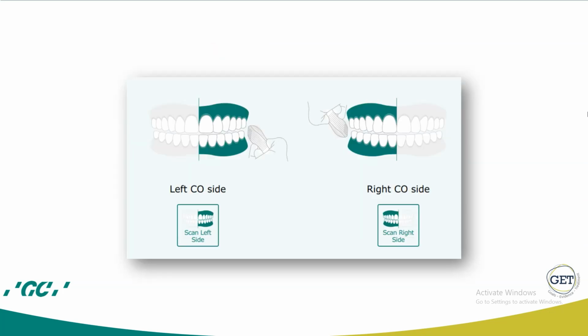You will scan both arches and then you will use the option centric relation or centric occlusion. If you scan centric occlusion, please have the patient bite, take the scanner head and scan as shown on the left or the right side. If needed, the software will tell you both sides.